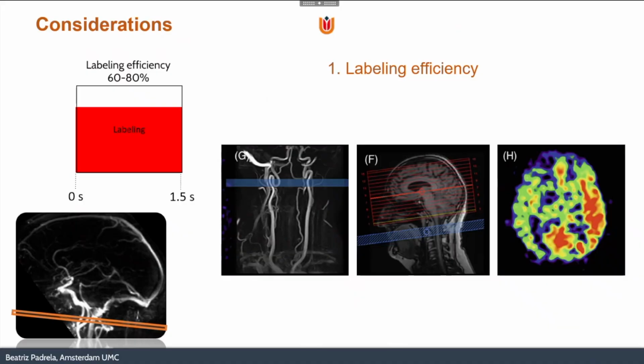And also, as we mentioned, for example, here you see on the left, the blood is getting labeled in multiple parts of the same artery. So these will create some perfusion changes, for example. These will happen, yeah. I mean, we expect blood going up in the arteries there. So can't we just cancel out the backflow in some way? Yeah, but the best here would be to just lower down the labeling plane.